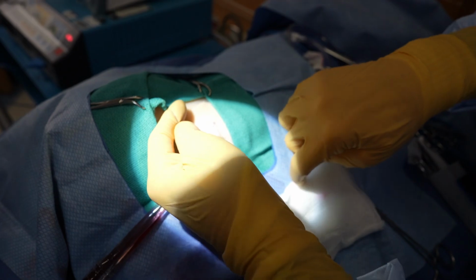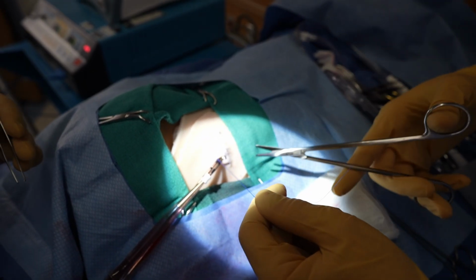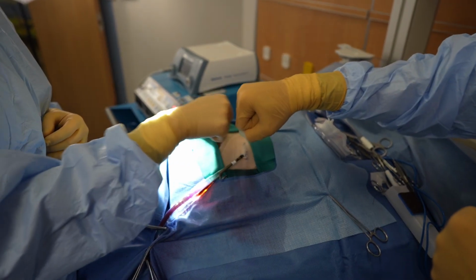Now you will obtain a chest x-ray and/or echocardiogram in order to verify tip position. Great work, team. You've cannulated the patient, and now they're on ECMO.